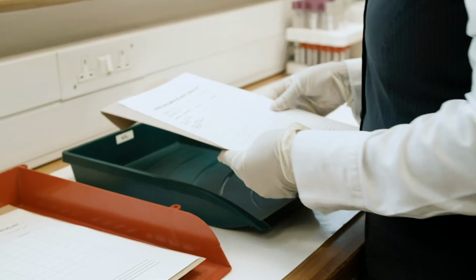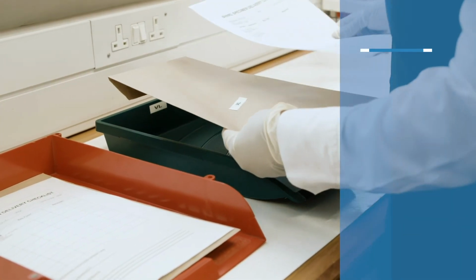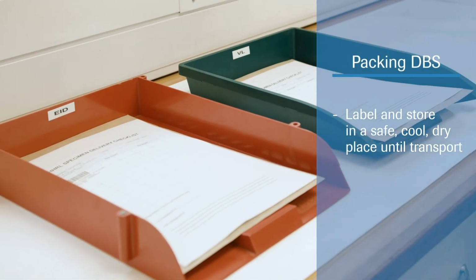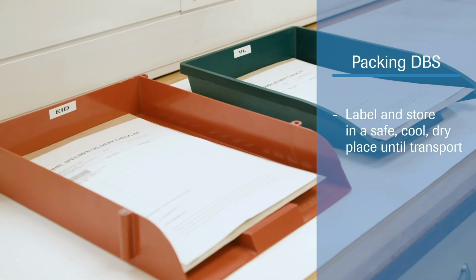If the packet is not going to the lab that day, leave it in a cool, dry place away from light until it is ready to be transported. Avoid leaving the DBS in a vehicle, as sun and heat will deteriorate DBS.